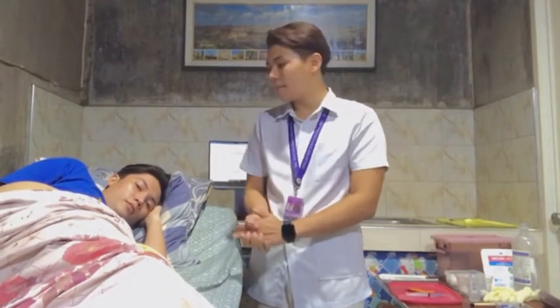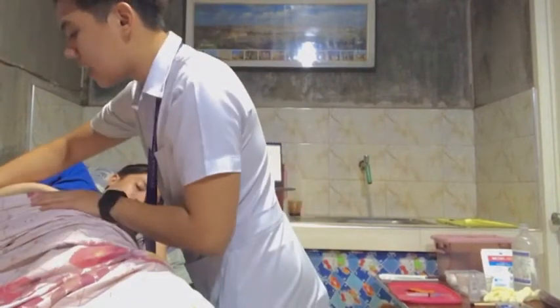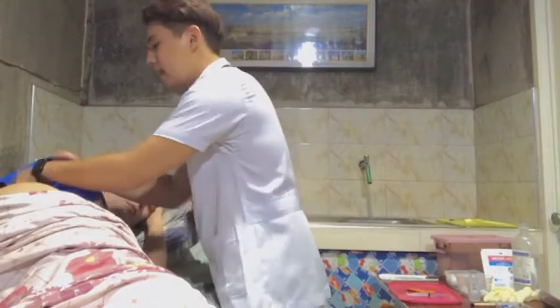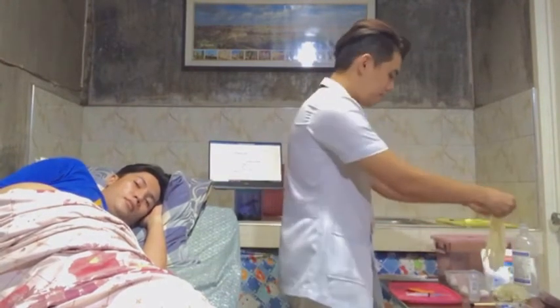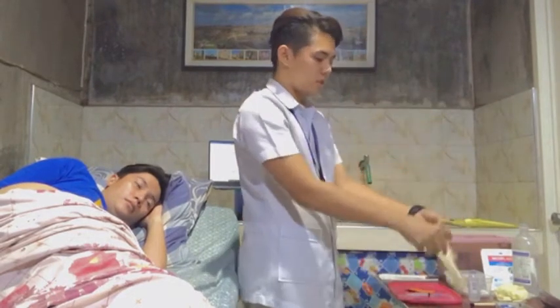Next is to help the patient find the comfortable position that will accommodate the injection sites you have chosen and only expose the sites. Okay, sir. So as I have done earlier, I'm going to ask again, is this the most comfortable position for you, sir? Okay. So next is that we will be applying clean gloves again and use anatomical landmarks to find the sites again. So this is the clean gloves again. Just wait for a minute.